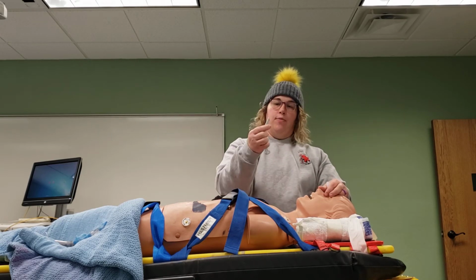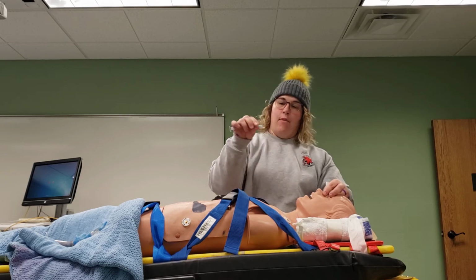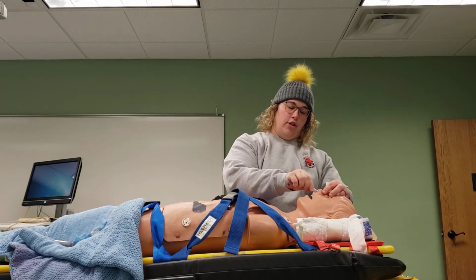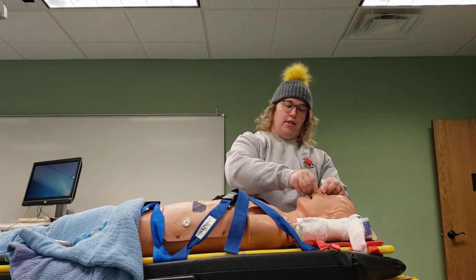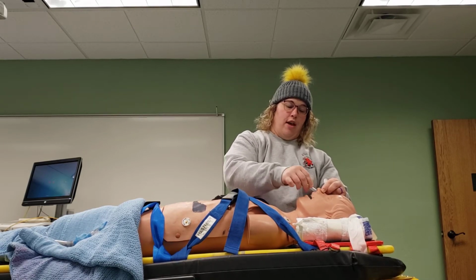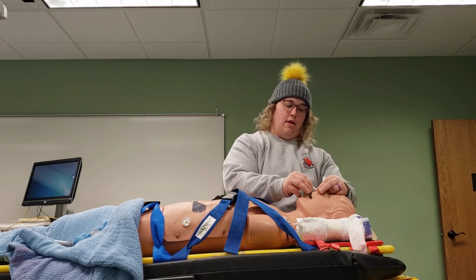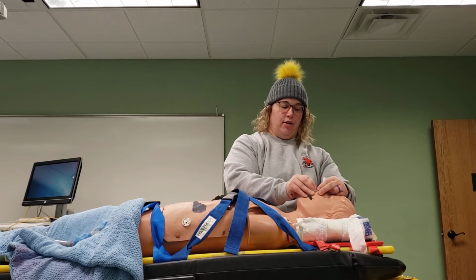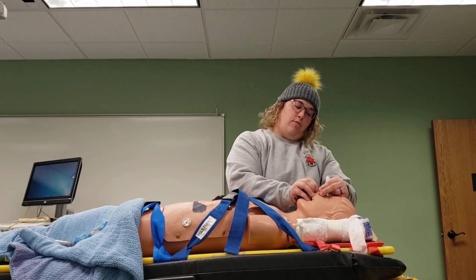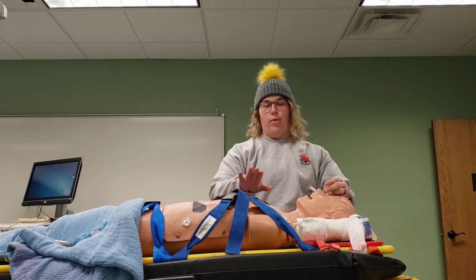So you want to lube this up. Don't use your mouth, it's disgusting. Use some actual lube, and then just making sure the bevel's on the inside toward the middle of the nose. You're just going to insert it and then gingerly twist it down all the way until the trumpet portion of the NPA meets the patient's nose. And poor little Johnny here has had a lot of action, so I don't think it's going to go all the way down on him. In any case, once you have that inserted, it should be able to then push air past that tongue that may be obscuring the airway, and then it will help that rise and fall of the chest.